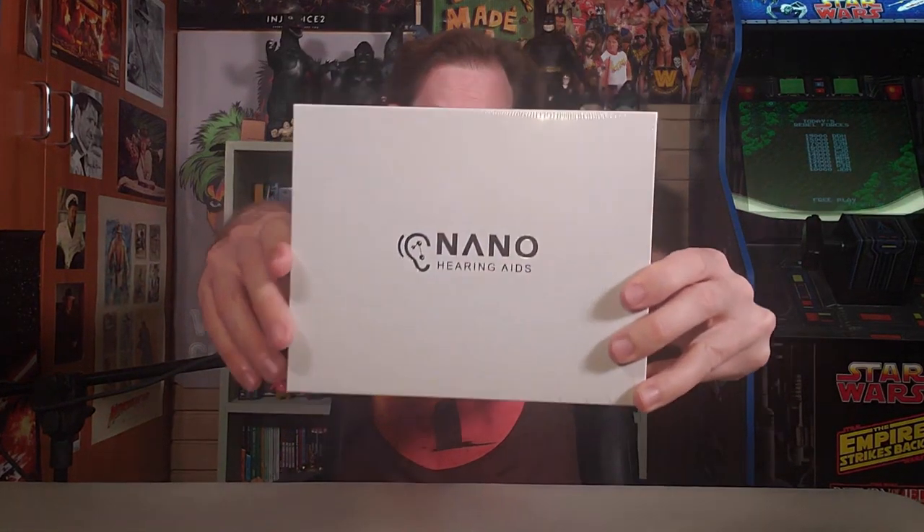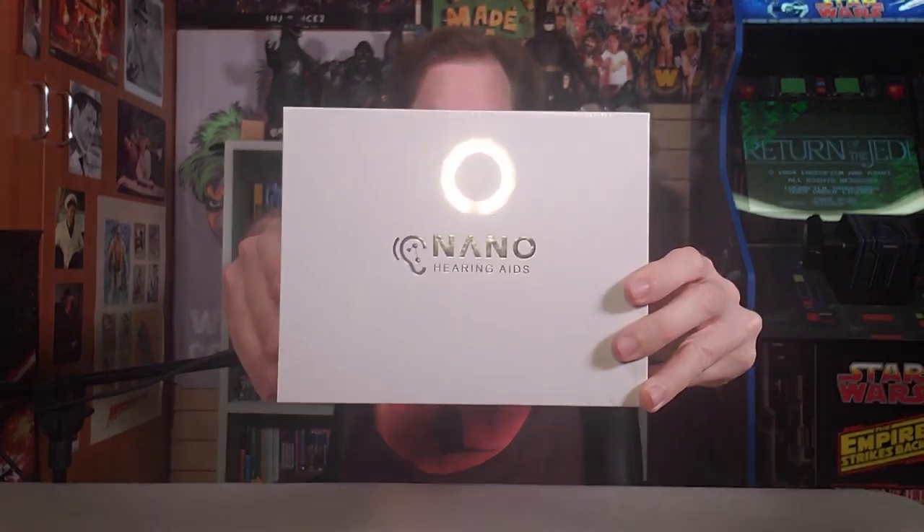This is Nano Hearing Aids, sent to me by the fine people that never say 'And what was that?' over at Nano Hearing Aids. They're great. This is awesome.